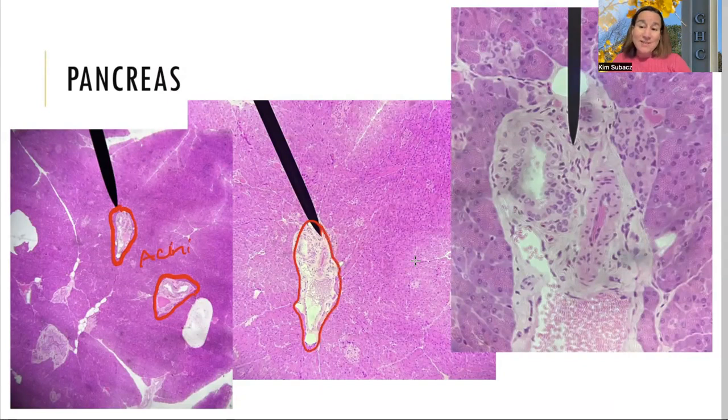Pancreas is super cool because it's both endocrine and exocrine. Exocrine is going to be all of those dietary secretions that we talked about, the proteases, the lipase, the amylase for all the different macros. Pancreas secretes those as far as exocrine properties. For endocrine properties, islet of Langerhans is where it's at. So these little light pink areas on here, not the acini and the purple stuff. We want to talk about the light pink stuff. So the light pink stuff is islet of Langerhans.